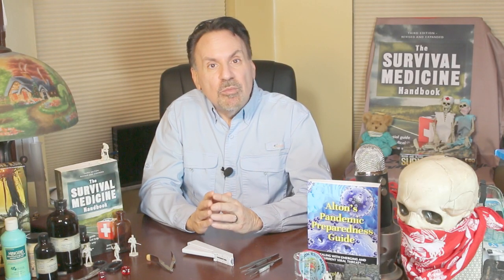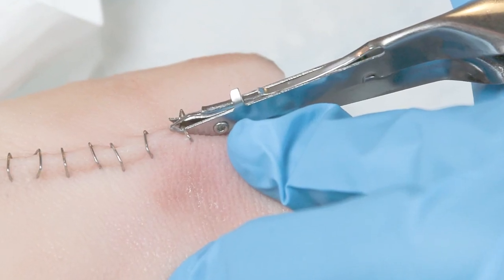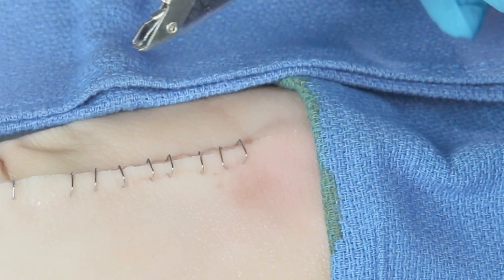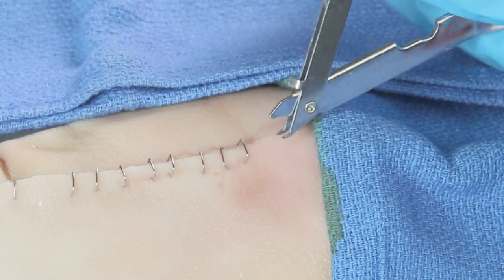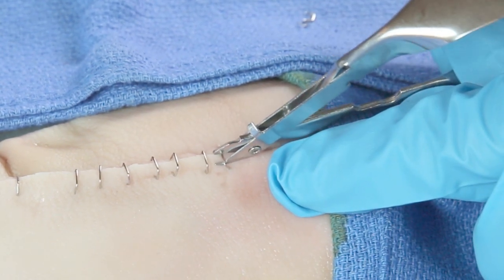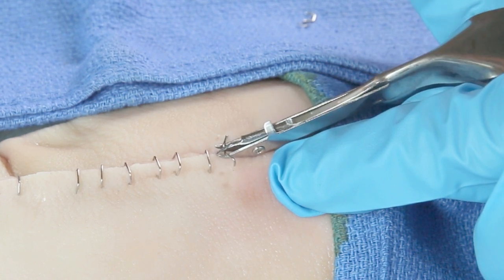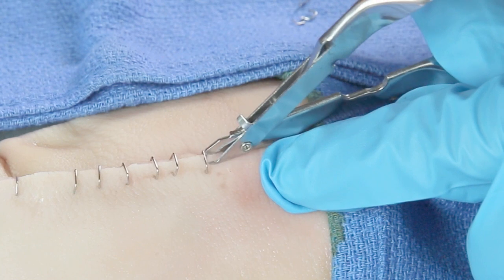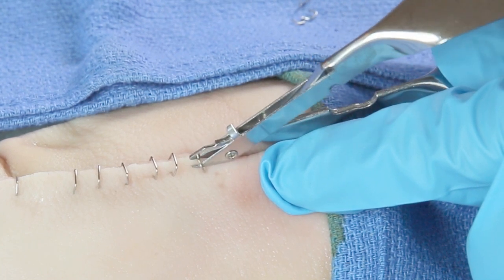Like most skin sutures, staples require a removal procedure. For sutures you only need a small scissors, while a special instrument is needed to remove staples. This particular remover has two prongs on the bottom and one on top. Place the two prongs under the staple to be removed, clamp, and you'll see the staple begin to rise. After clamping, pull straight up, and the patient will barely know you did it.